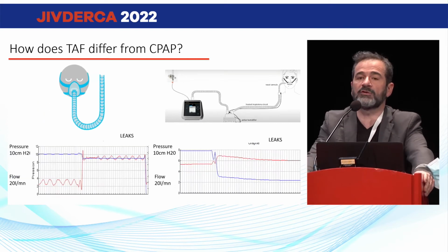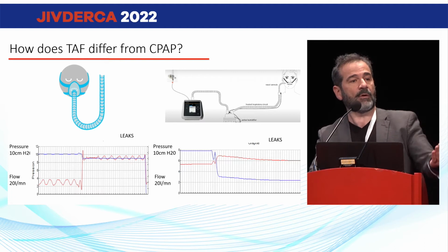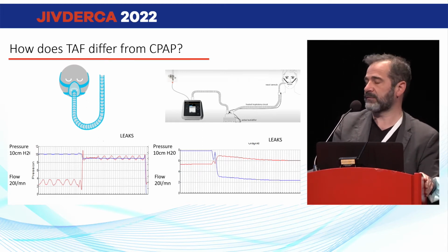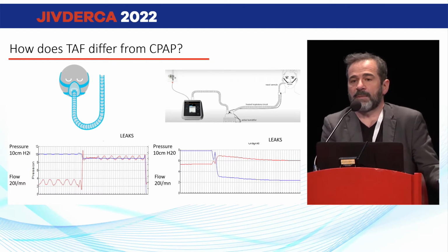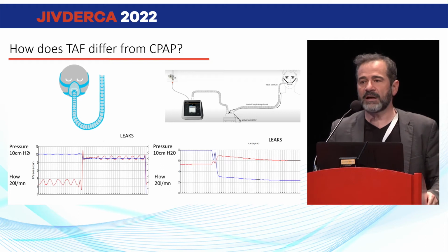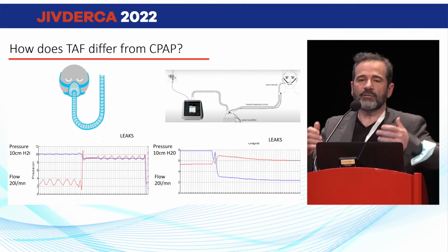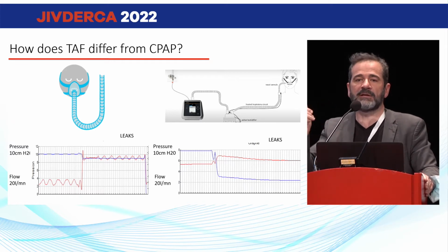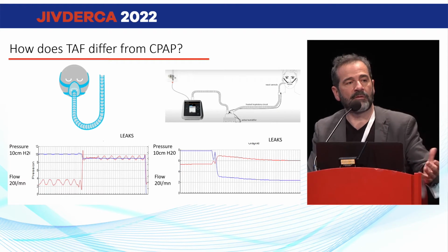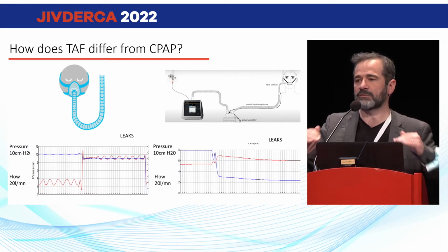The most important thing to understand is the difference between a CPAP and a high flow therapy, because both send a very high flow, and both produce a pressure. That's why we can have a CPAP effect with a high flow therapy, and we have flow with a CPAP because the pressure is produced with the flow. And you see here that in fact it's exactly the same device, but the problem is when you have leaks. With a CPAP, the target is to maintain a constant expiratory pressure, so when you have leaks the device is going to increase the flow. With high flow therapy, as the target is to maintain a high flow, the pressure is going to decrease if you have leaks because the flow is going to be constant.